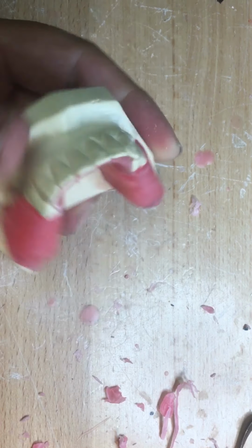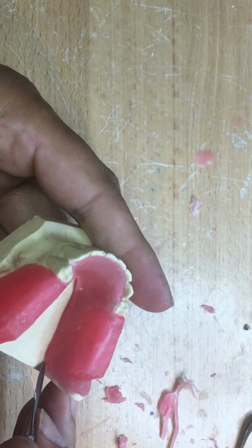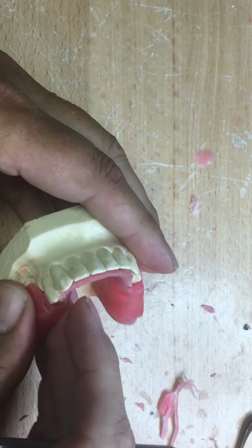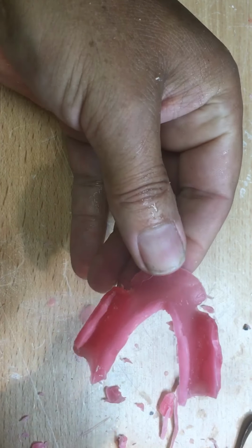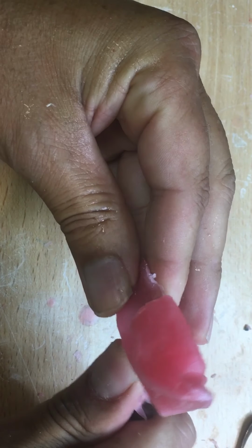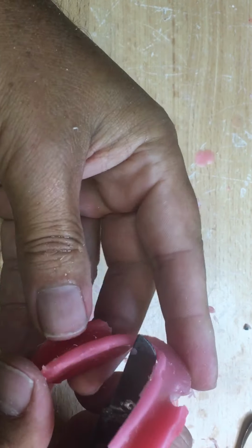Now, I'll be back in a second. I'm just going to cool that out. I lost patience waiting, so. As you can see when I take it off, it's almost seamless between my light cure and my base plate wax. Should be the same extensions of a denture.